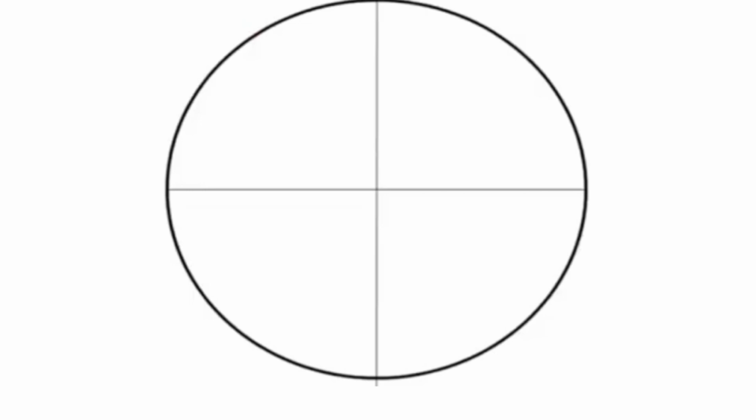Suppose this is the x-axis and this is the y-axis. Lead 1 is in this direction, we call it lead 1, and AVF is in the direction of the y-axis.